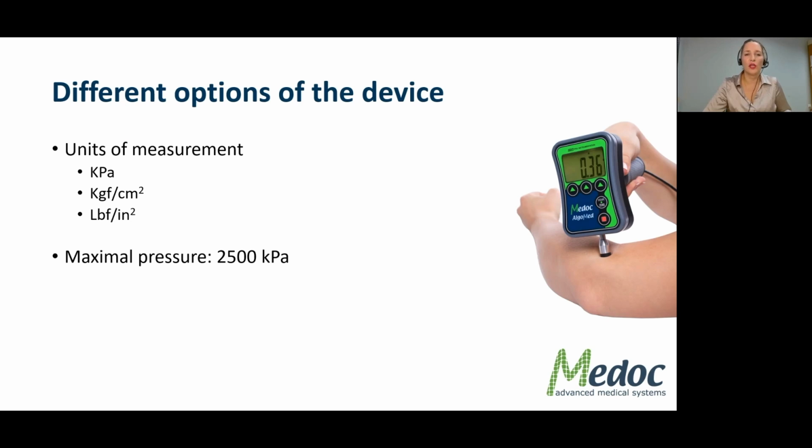And the maximal pressure that you can exert, or that this device measures, is 2500 kilopascal. So that's quite a lot. I don't remember ever reaching a pressure pain threshold of 2500 kilopascal with anybody that I tested.